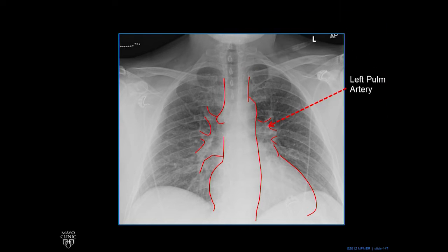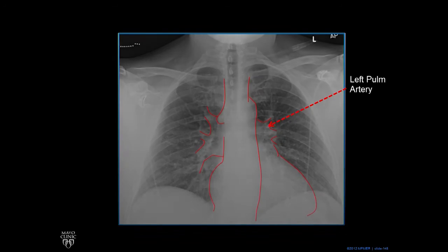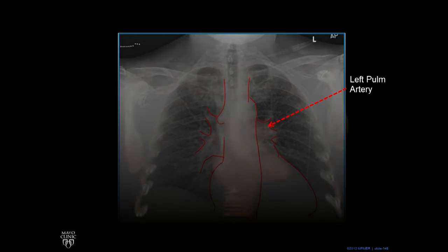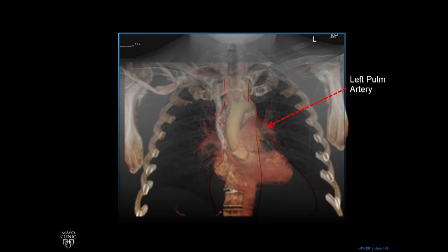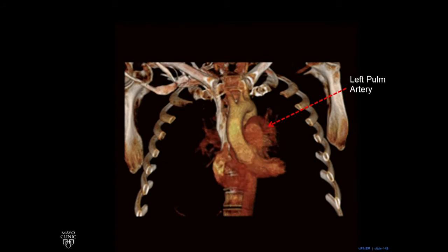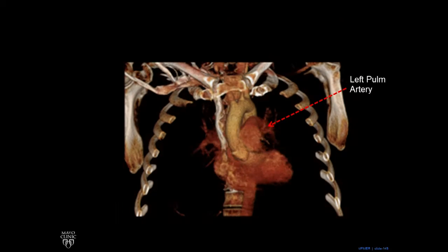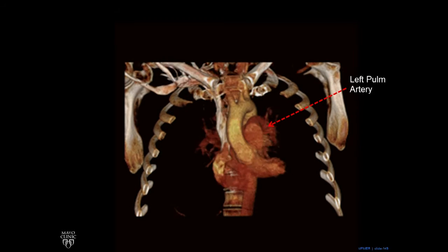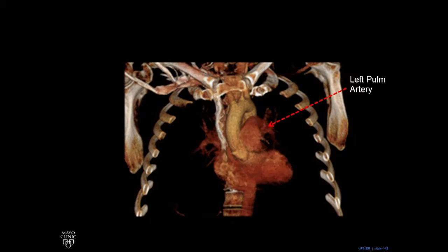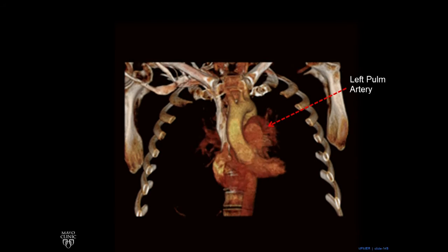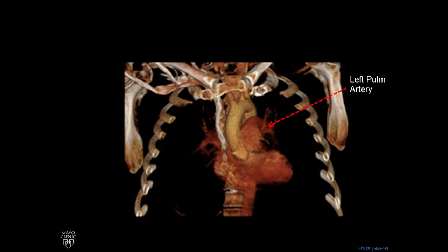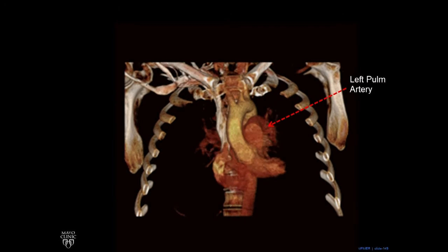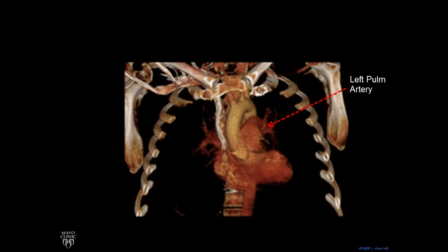We pull away our view and pull up the chest X-ray. You can see the left pulmonary artery is running front to back more or less over the bronchus, whereas the right pulmonary artery runs more right to left.